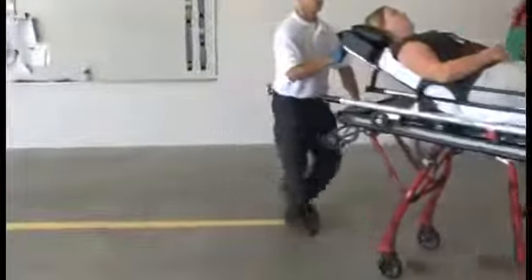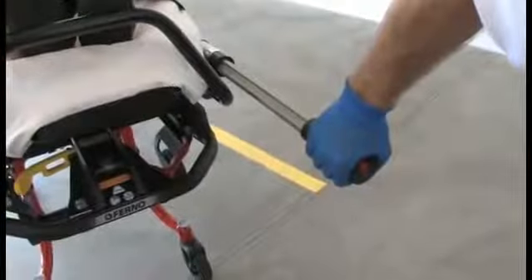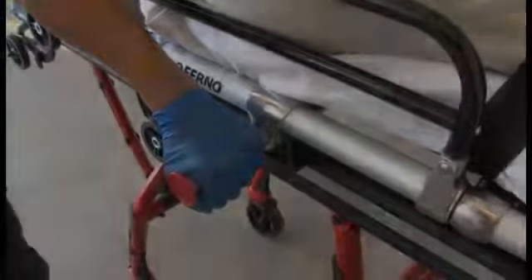To roll the cot when you are the control end operator, pull the cot by grasping the stretcher foot handle or pull-out handles. When you are the assisting operator, pull or push by grasping the mainframe at the center of the cot, at the load end of the cot, or by using the pull-out handles.